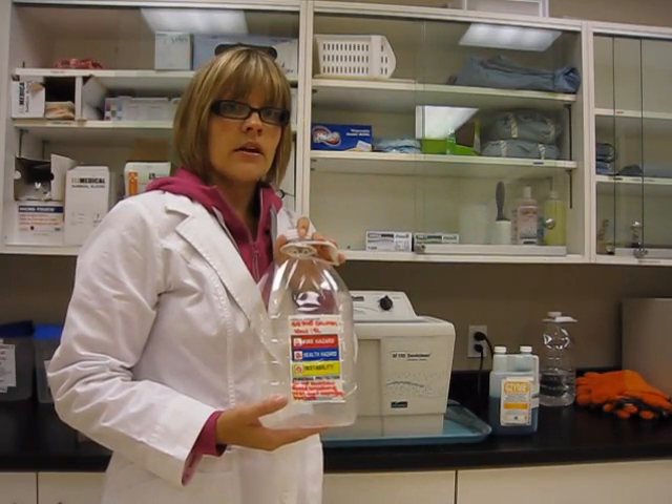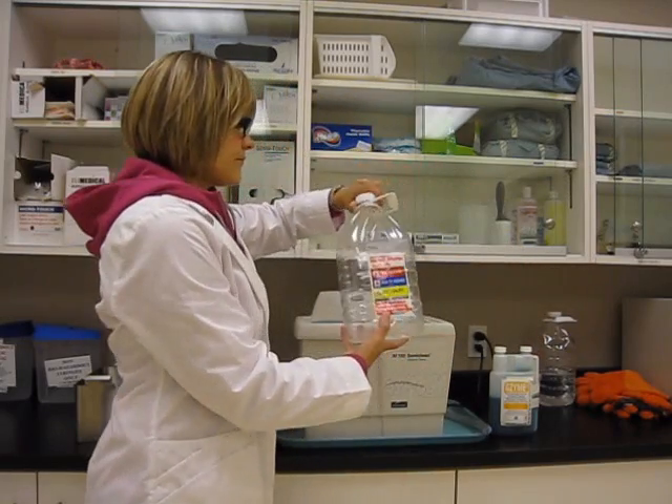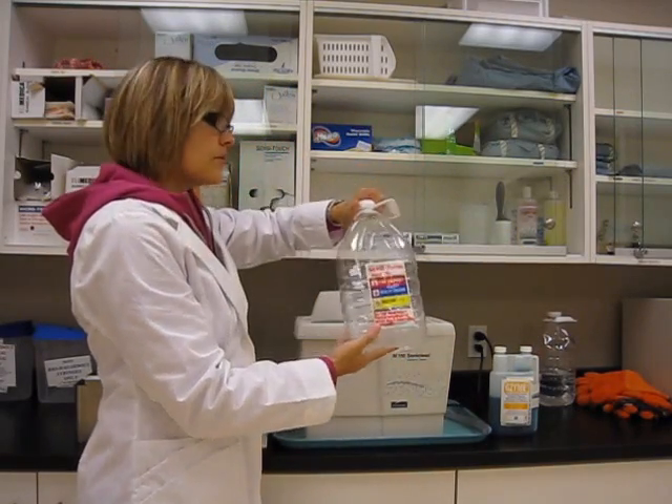You can add your water and add your Gazime in here, shake it up, and pour it into the reservoir.